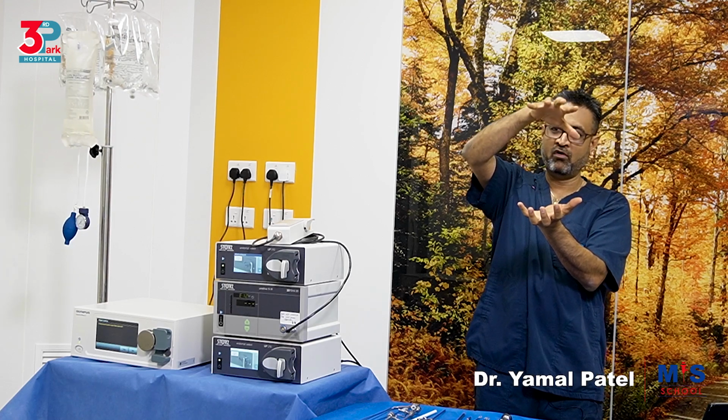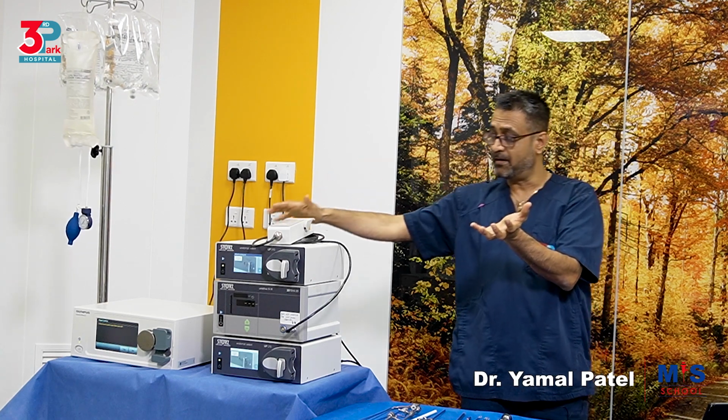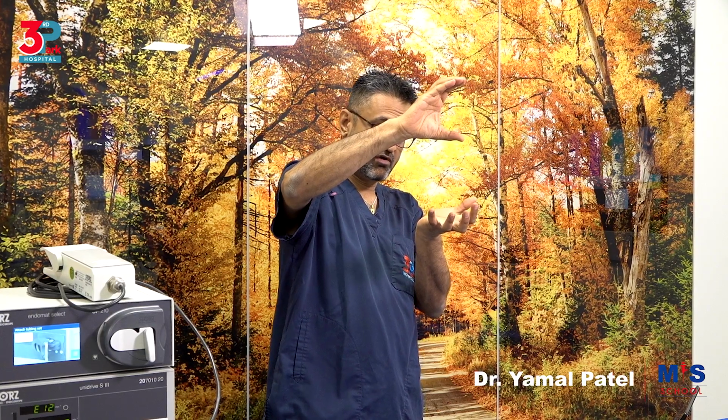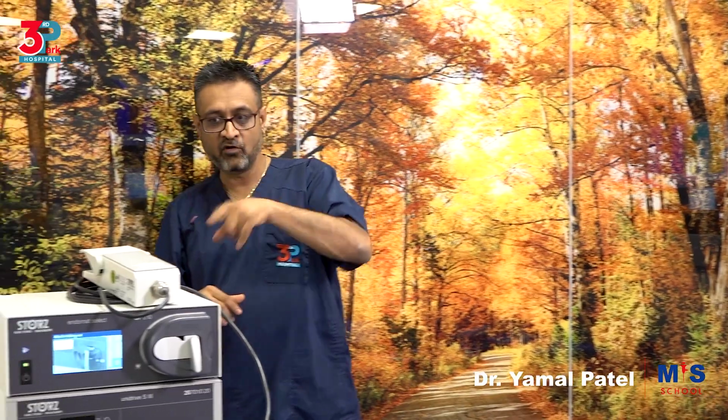When there is a little more and it's not leaking and there is too much distension already, the pump slows down. So it gives you a constant pressure to give you a constant view at all times, whereas the flow will keep on changing based on the machine. And because it's continuous flow, it clears any debris quickly, and therefore you have a good view at all times. So please remember these three words: continuous flow, constant pressure, variable flow.